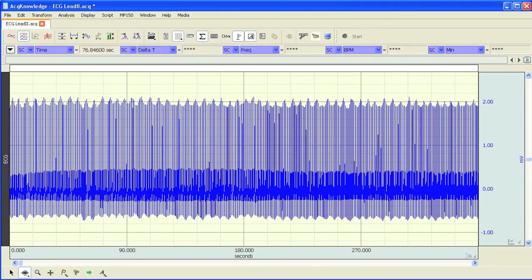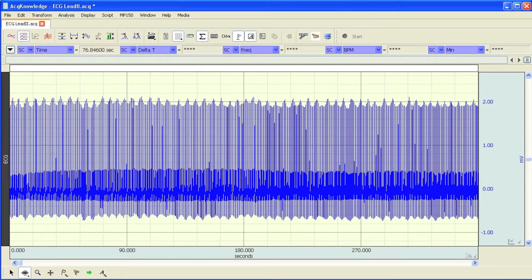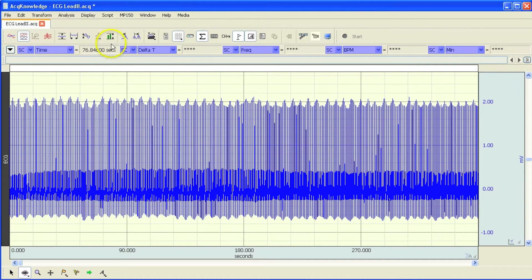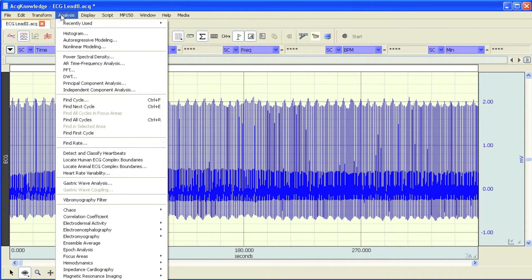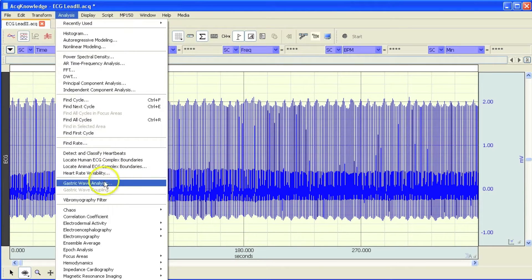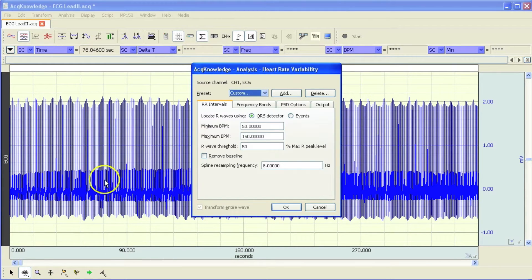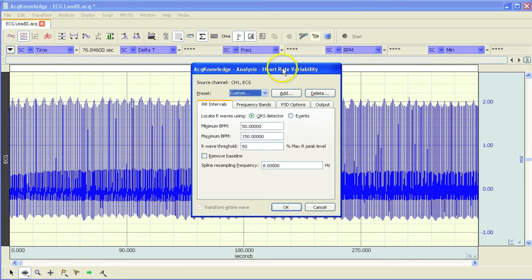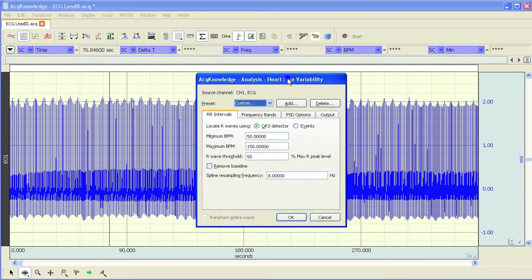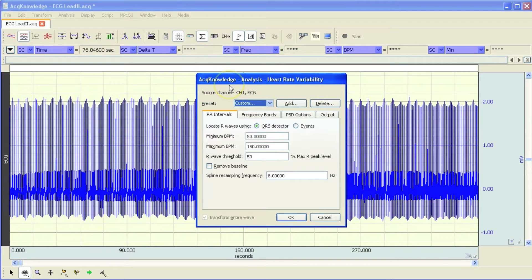The following screencast will provide you with a demonstration of Acknowledge's fully automated heart rate variability analysis routine. The HRV analysis option is located under the analysis menu. When you open up the dialog, you are confronted with a multi-tabbed window that guides you through the analysis process.